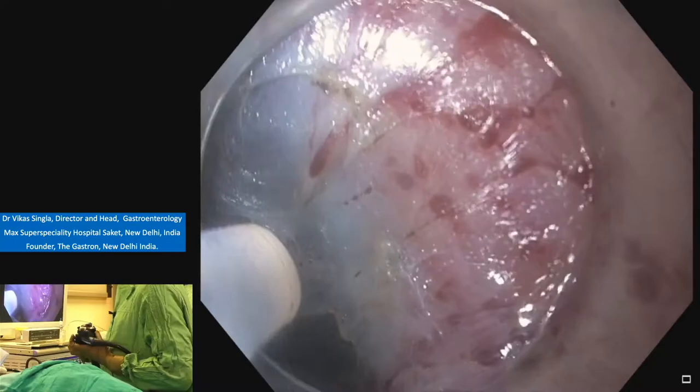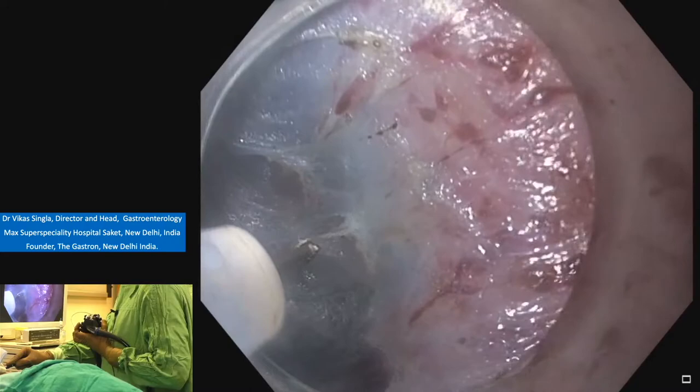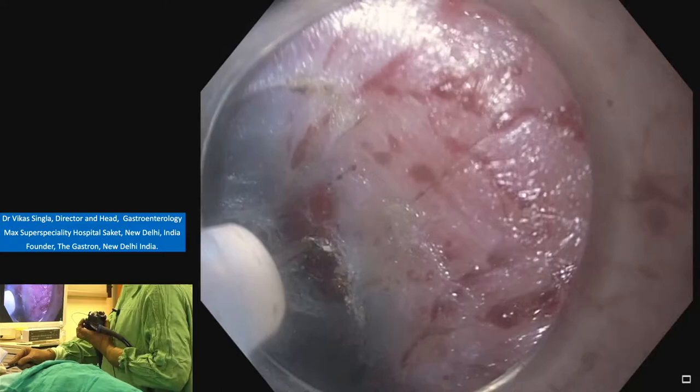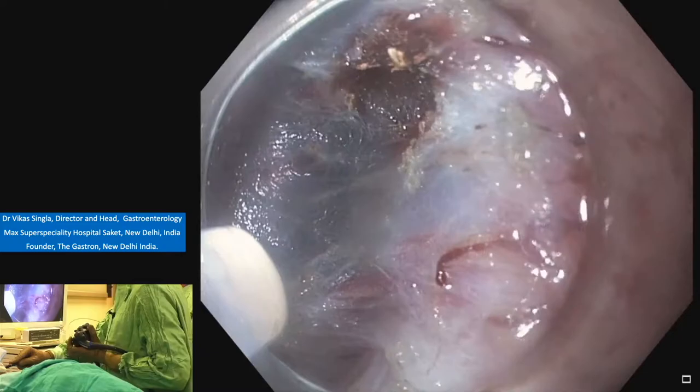Inject. Very careful dissection required, very careful. Some bleed there, you have to see. Right out.